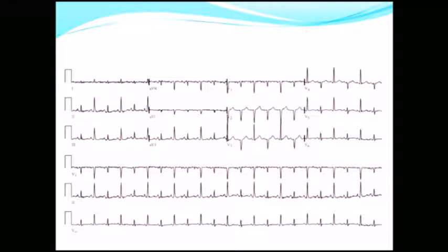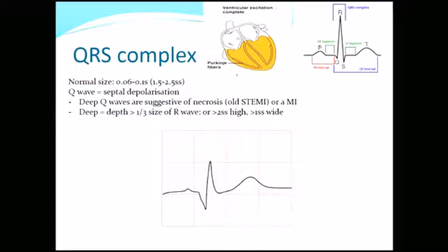Okay. So remember, if we've got a large pericardial effusion, first of all, you can see the QRS complexes are also of quite small amplitude, right? Everyone can see that. And that's because there's physically more distance between your electrode and the heart. The QRS amplitude will be smaller. Now, the reason why it's alternating is because if there's so much effusion, your heart can literally swing back and forth, resulting in this pattern we call electrical alternans. Okay? It's because the heart's swinging back and forth. Does that make sense? Cool.